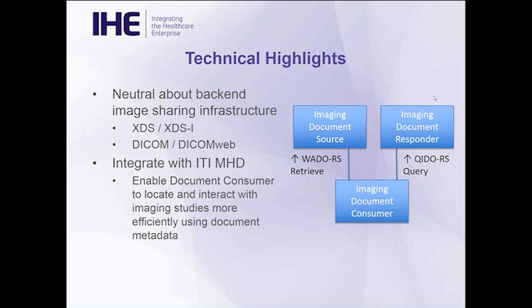So instead of having to fetch the manifest and parse the DICOM key objects, for example, using this profile gives you a more efficient way to interact with the imaging study. Especially, for example, you can do a query to find additional study metadata.